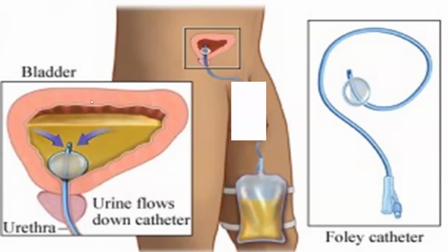Why? Number one, sometimes the urine is a little amount, so you will drain the urine. If it is above the fluid level, you will not drain, right? Number two, the holes of the catheter will not touch the top of the bladder. It would obstruct the holes and it will also make the bladder bleed. Clear. Okay, done. Then you will attach it to the bag.